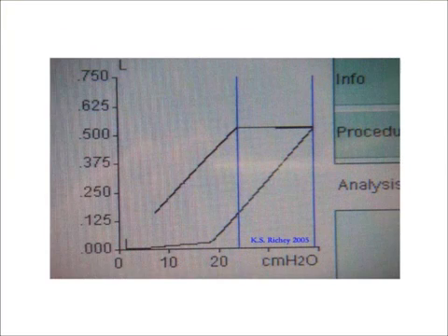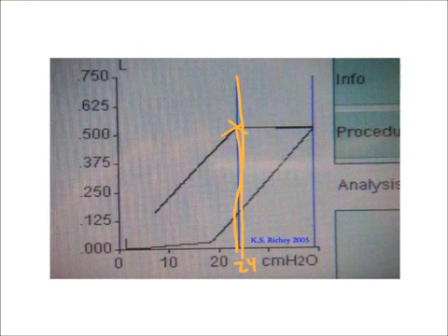However, here's an example of the same curve. And with this tool, it allows you to assess the expiratory limb too. And with the expiratory limb, I can see the closure point or the points of derecruitment. And this is highlighted right here with this scroll point. And it's approximately right there. Let's call that about 24 centimeters of water.